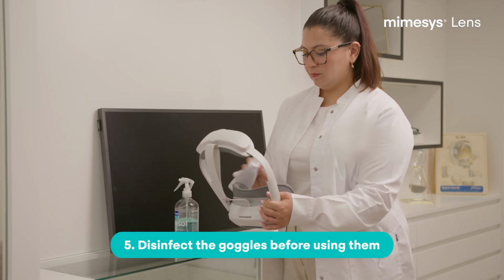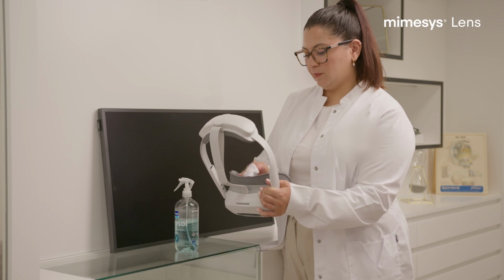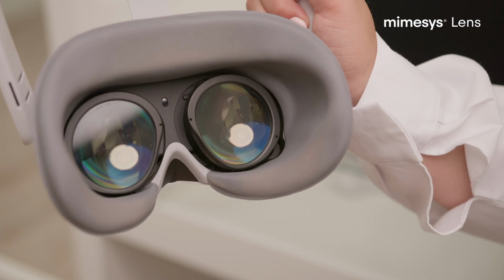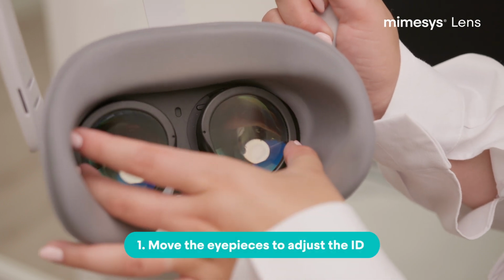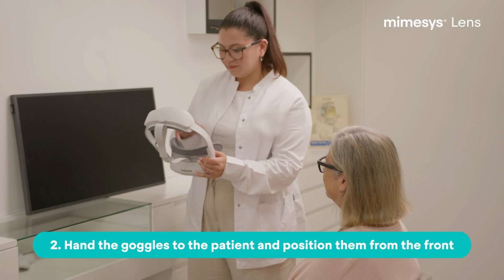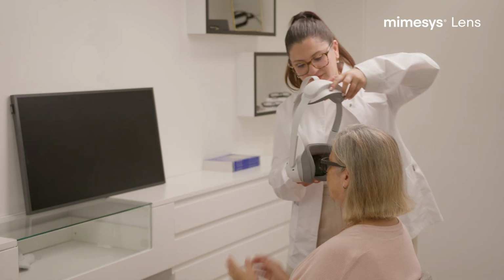Disinfect the goggles before using them. Help the patient to adjust the interpupillary distance by moving the eyepieces. Hand the goggles to the patient. Position the goggles from the front for comfort.